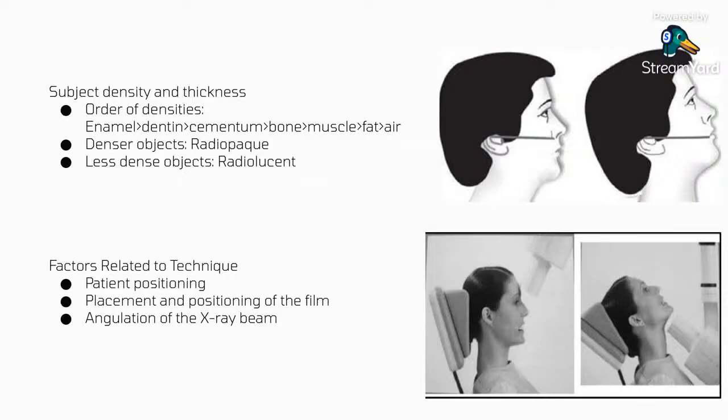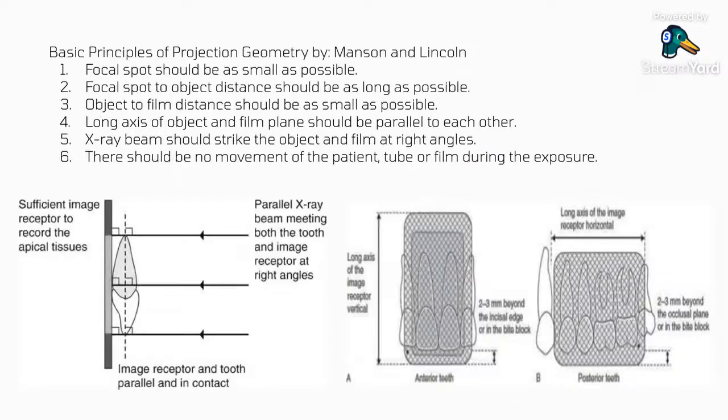Okay, the factors related to the technique on how a dentist actually captures the radiograph are the patient positioning, placement and position of the film, and the angulation of the X-ray beam. Let's discuss them. Okay. All right.